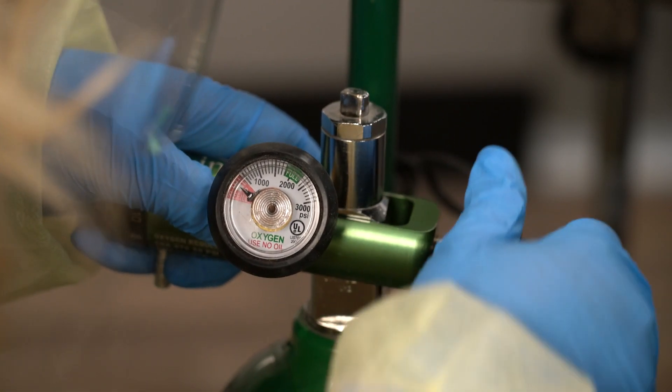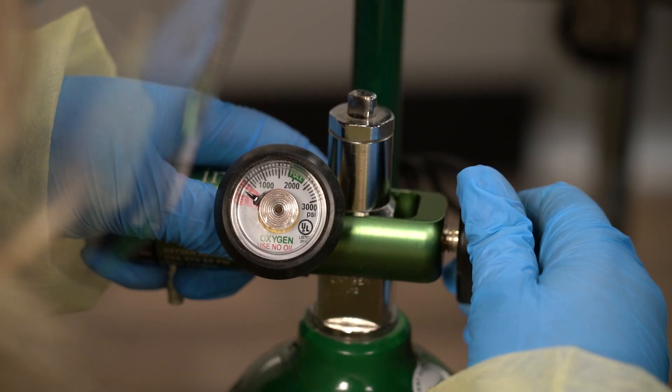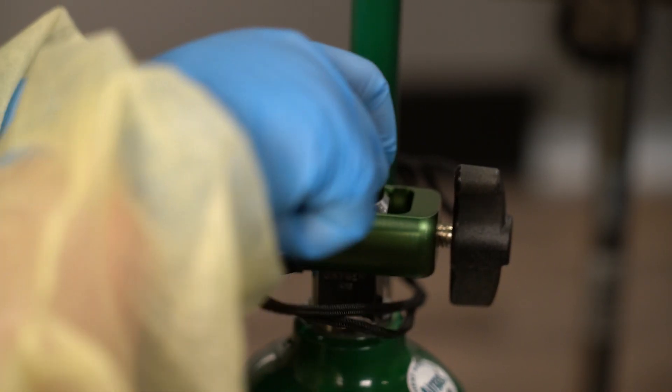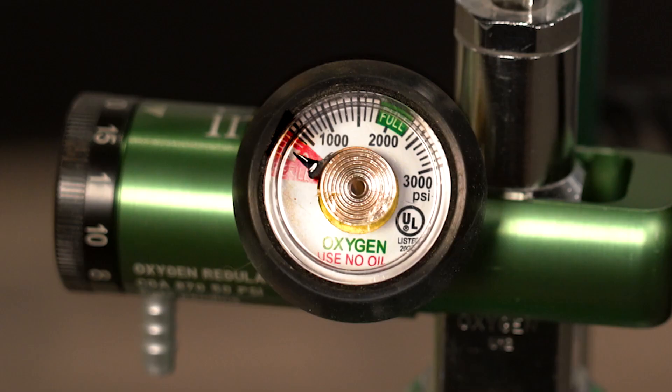First, attach the regulator to the tank. You don't have to screw it in too tightly, just enough so it's secure. Slowly turn the valve counterclockwise to allow oxygen to flow. Next, check the pressure gauge to make sure the needle is not in the red zone. If it is in the red zone, that means there's not enough oxygen in the tank.